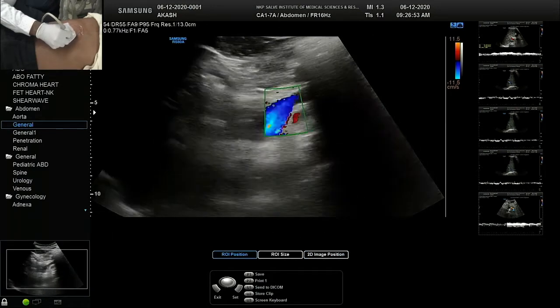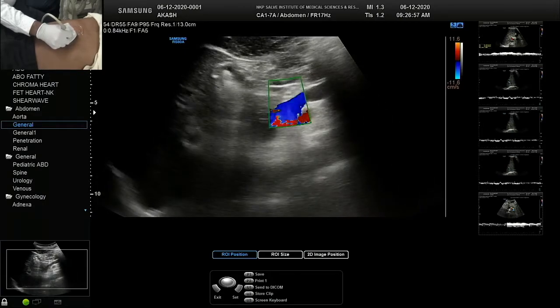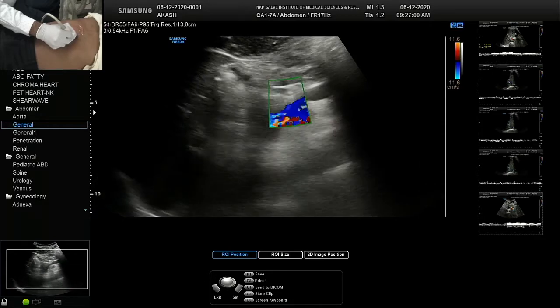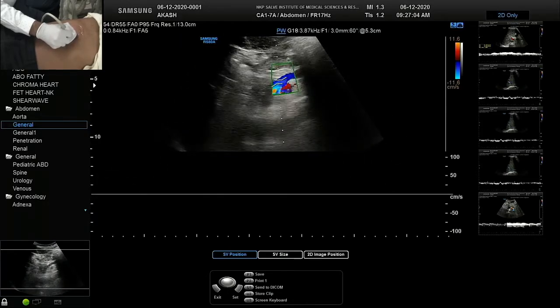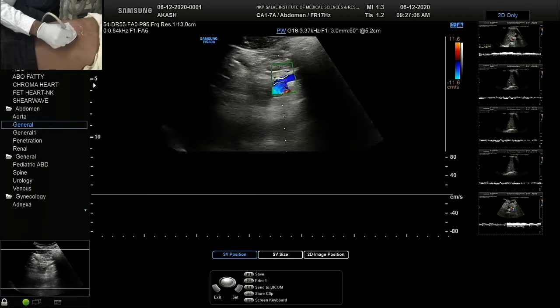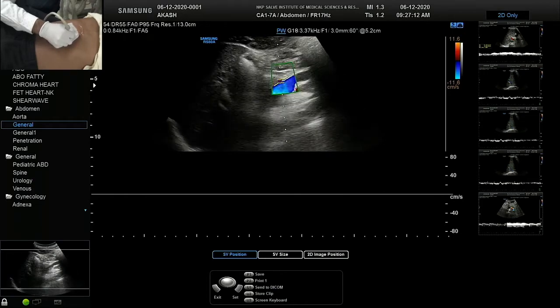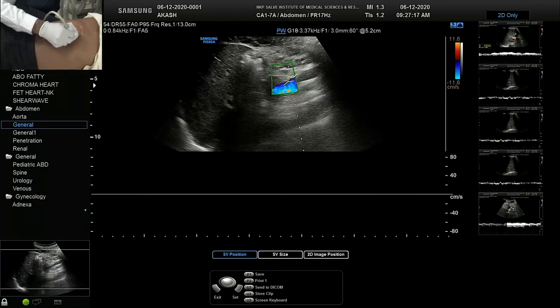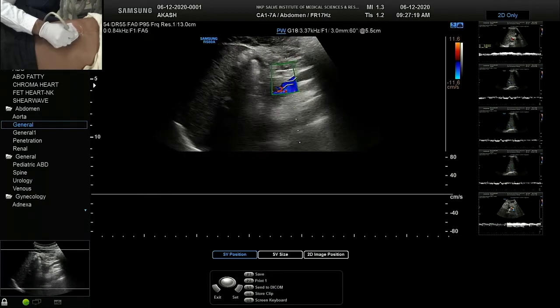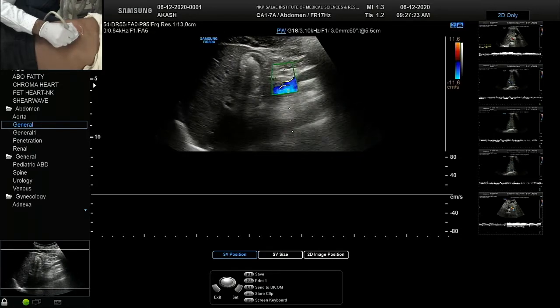All the vessels in portal and renal, we should remember that we may not get a complete spectrum full of screen, because definitely there is movement due to respiration. In a peripheral artery or vein, we expect the screen to have multiple waveforms for evaluation of the Doppler. But here, 3 good waveforms should give you information about the flow in that particular vessel.